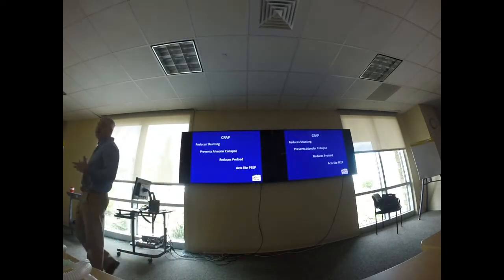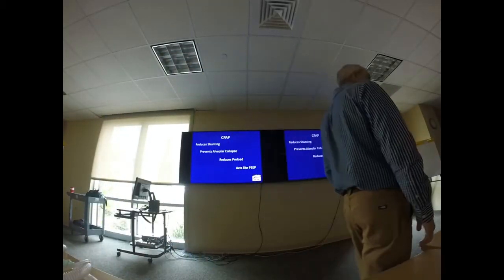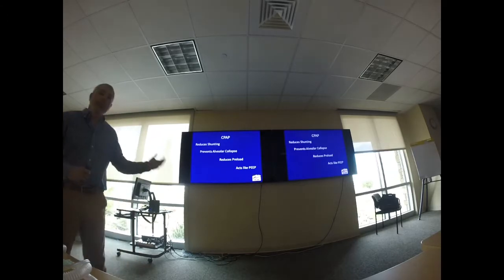So CPAP is a lot like PEEP, and I show up at 2025 North College, and I've got a patient who's in a recliner chair, and they've got jugular venous distension, they've got hepatosplenomegaly, they've got pitting edema. You know, back in the old days, I'd nasally intubate that patient, right? But today, what I can do is provide them with CPAP, do all of these effects right here, probably reduce the chances of them being put on a ventilator, and decrease mortality and morbidity with continuous positive airway pressure. That's CPAP.